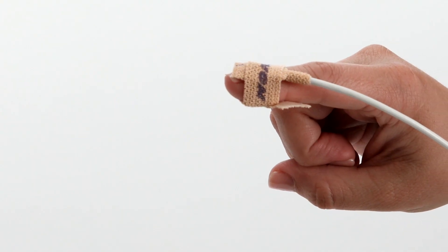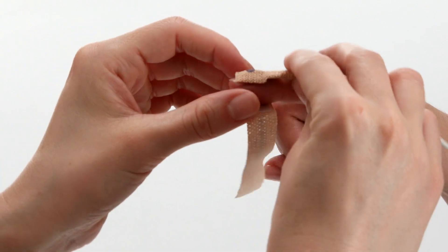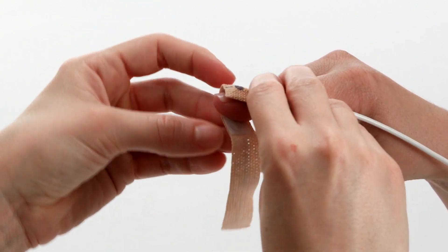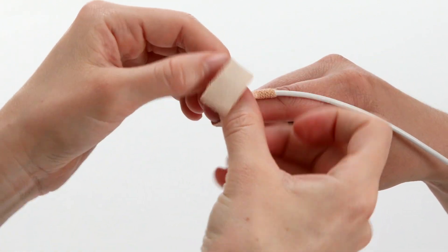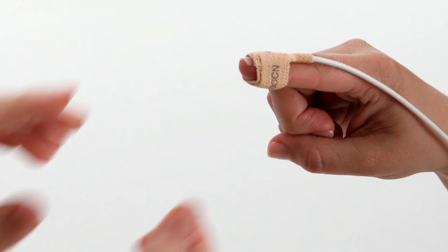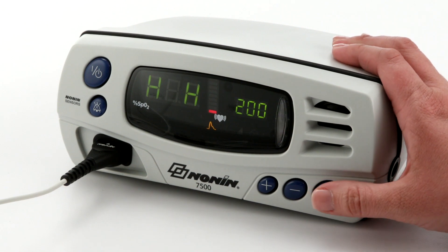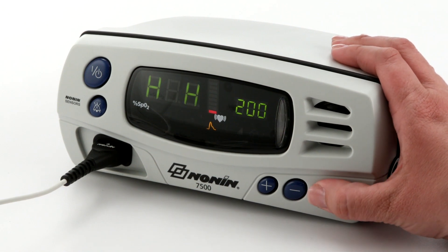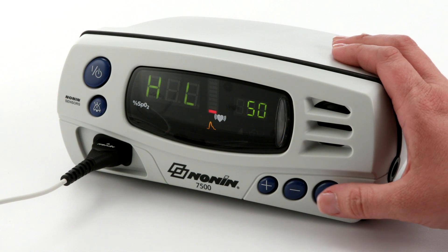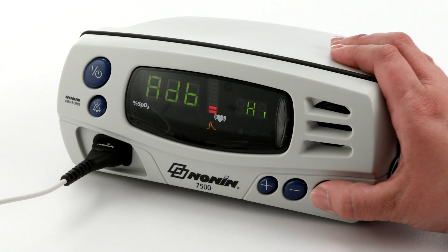Check and correct the position of the sensor if it has moved, and recheck the sensor connection to the oximeter. Hybrid averaging mode will take these short desaturations into account, reducing the potential of false alarms. Audible and visual alarms can be set to signal if either oxygen saturation or pulse rate go outside the predetermined ranges. Other oximeter functional conditions may also generate an alarm.